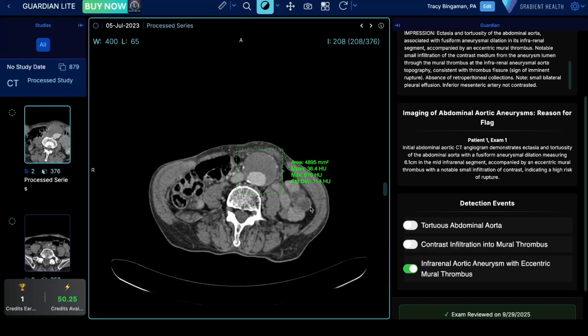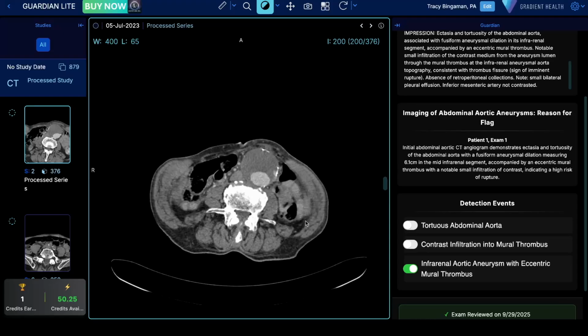Same thing here. This is infrarenal aortic aneurysm, which I think is, having never seen this patient, likely palpable on exam. So look at this abdominal wall. This is something that you can most likely feel and maybe even be able to see on exam because of this marked asymmetry of the anterior abdominal wall. I think that's a little bit contributed to the fact that the patient isn't completely flat, but also it looks like they do have a little bit of a bulge or outpouching of the wall here. That's more clinical than it is imaging.